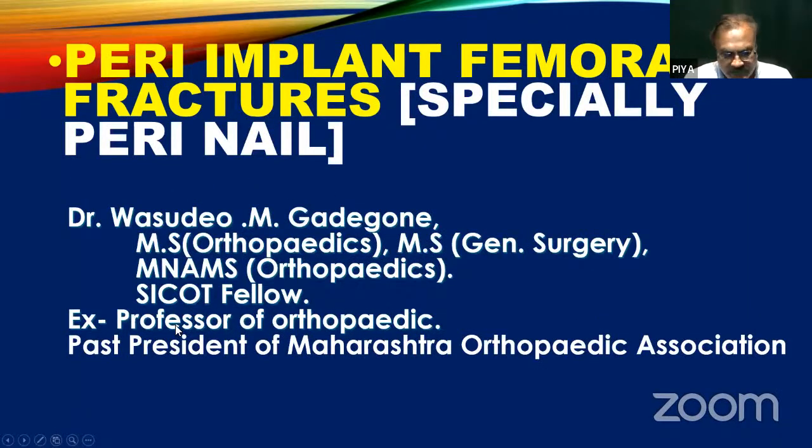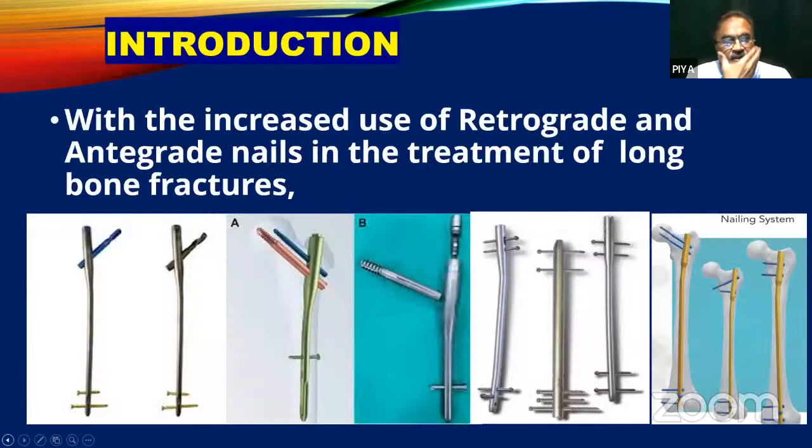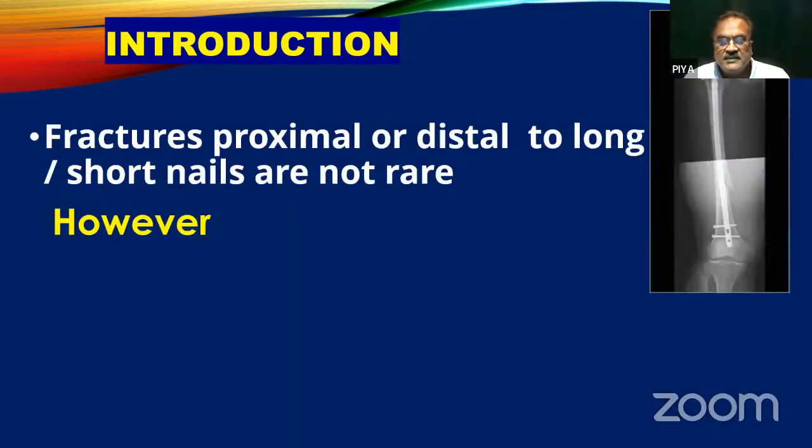Thank you, Chandak sir, for giving me a very difficult topic, that is peri-nail, especially peri-nail femoral fractures. Good evening, everybody. With the increased use of retrograde and anterograde nails for long bone fractures, this is the most important treatment nowadays for diaphyseal, proximal and distal femoral fractures.